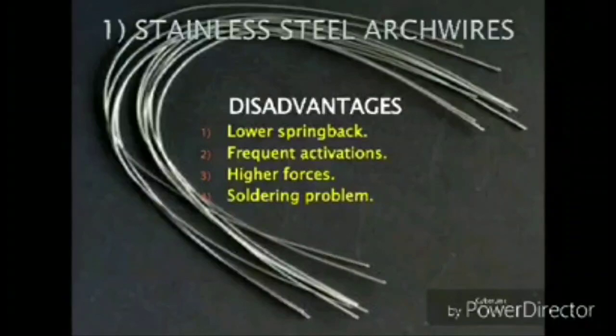Then, these archwires also deliver higher forces as compared to the wires made of other alloys of the same diameter. This may cause some discomfort to the patient. Soldering is demanding because if the temperature is higher than 500 degrees centigrade, it affects the corrosion resistance of the alloy.